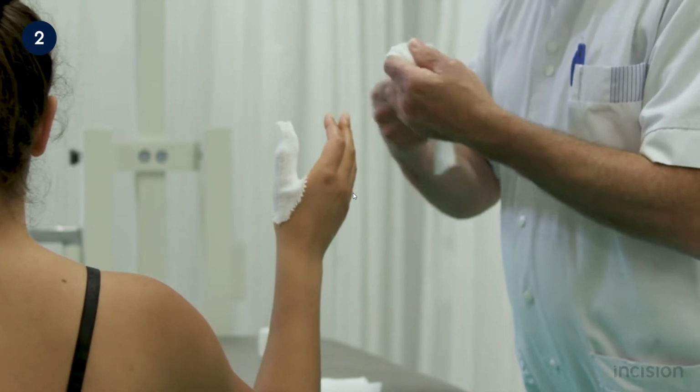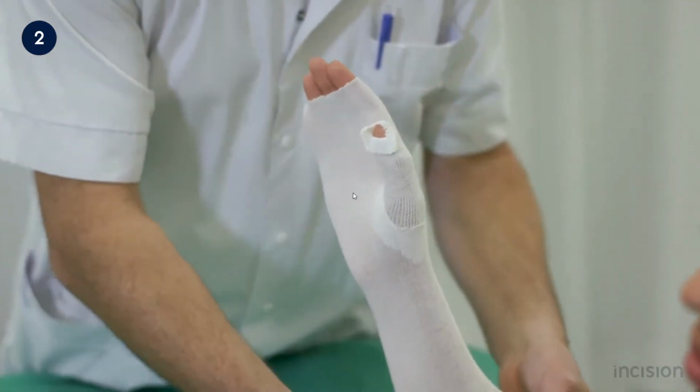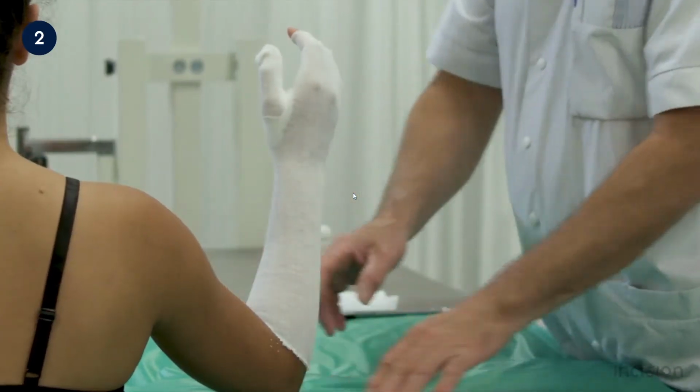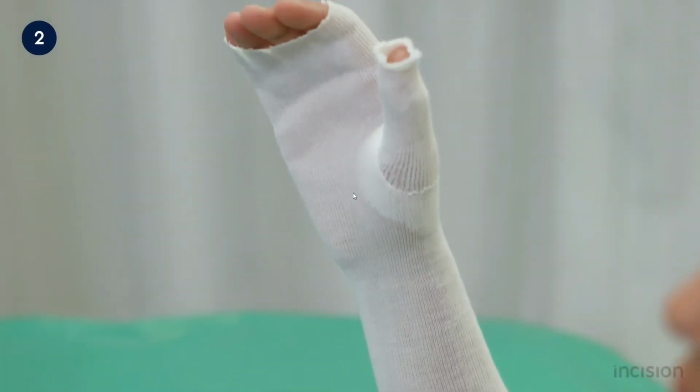The stockinette is applied over the forearm, at which the thumb is placed through the hole. Note that the stockinette is wrinkle-free, as wrinkling may cause irritation of the skin. Also note that the entire forearm and digits are included in the stockinette.